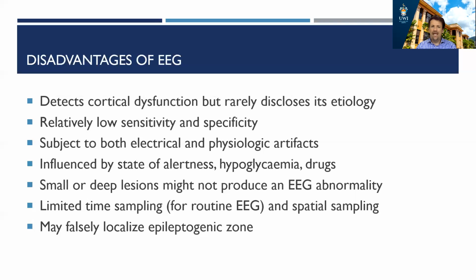So as we come to an end, I do want to alert you to the fact that the vast advances in technology within the last 10 years have now taken us to understanding and utilizing brainwaves in a very different manner, in something called BCI, or brain-computer interface.